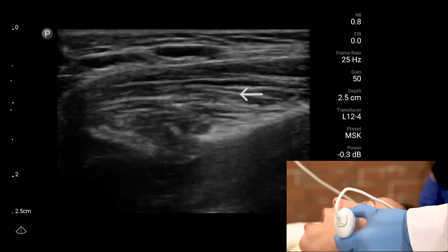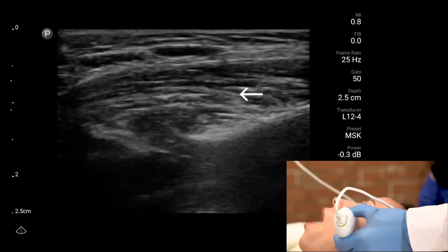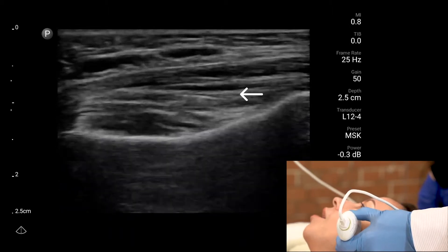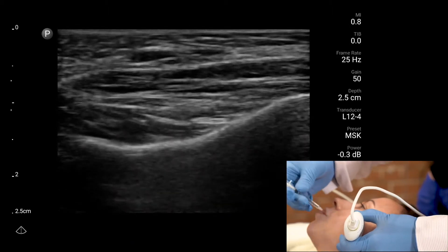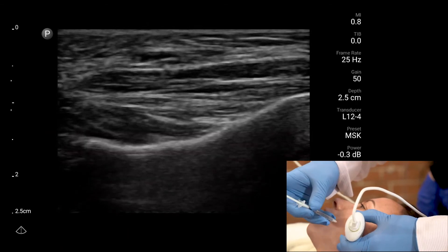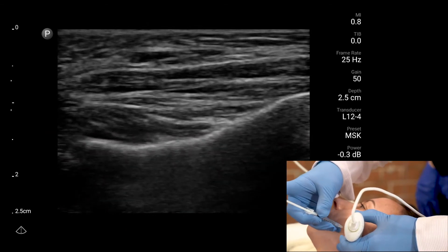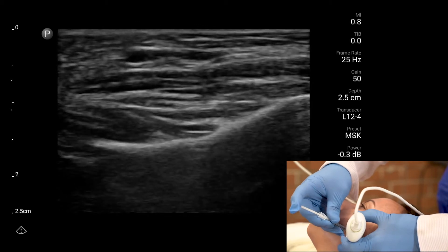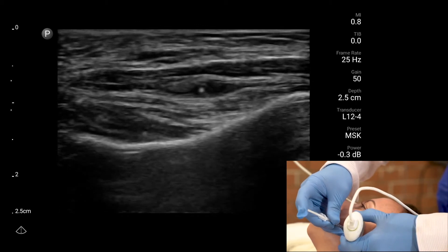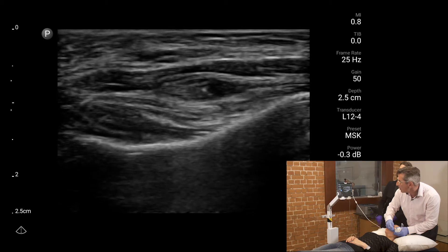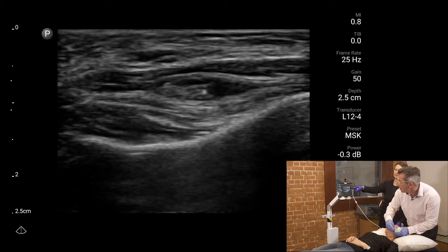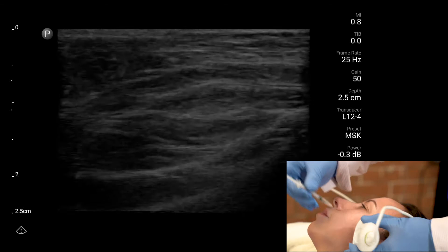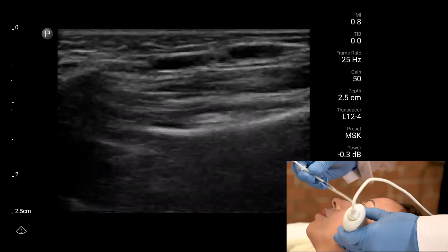Open and close your mouth — you can see the masseter in the centre of the screen. You should be able to see this quite clearly as I inject. Very still now, a little scratch. In the centre of the screen you'll see the tip of my needle. I tend to inject masseters at two sites. It's a broad, powerful, multi-pennate muscle.